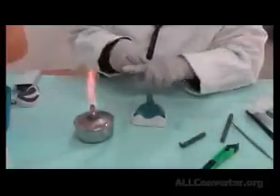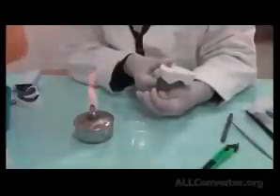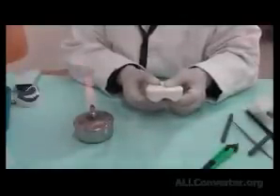And for this side, I ask him to move the mandible to the left and the right. What happens is, while the patient is moving the mandible to the left and the right, what we call the coronoid process will come close to this area, and it will border mold the width of the sulcus here. So, I would ask the patient, please, can you open your mouth maximally, go to the left and the right with your mandible, and this will border mold this area.